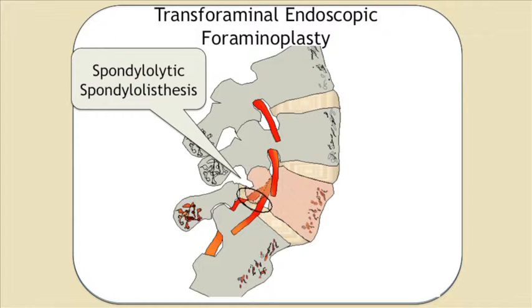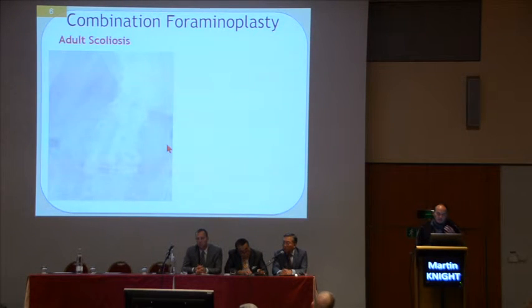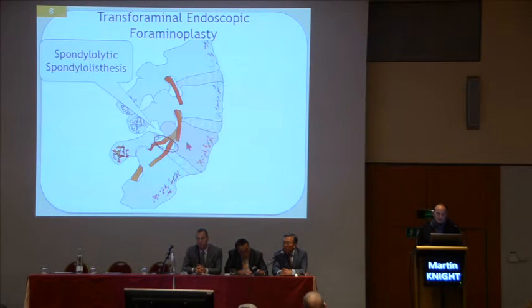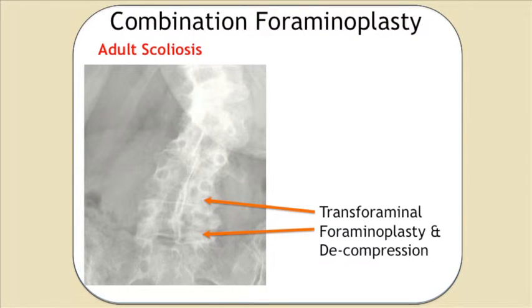What you're doing is cutting back the bone that is affecting the exiting and descending nerves. In many of these cases, they have a distorted disc, not quite like the one you've just seen, but most will have a distorted, very hard disc. You don't need to touch that. You need to mobilize the nerve and get rid of their pain, both back pain and leg pain. Here's a very dear lady with long-standing scoliosis who had a short history of, say, about 3 years of severe back and leg pain.